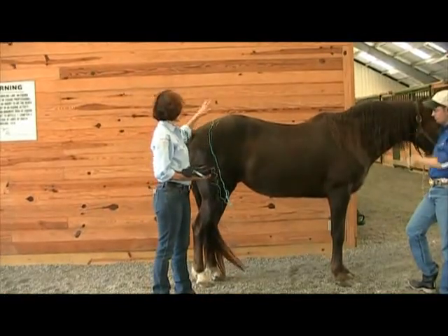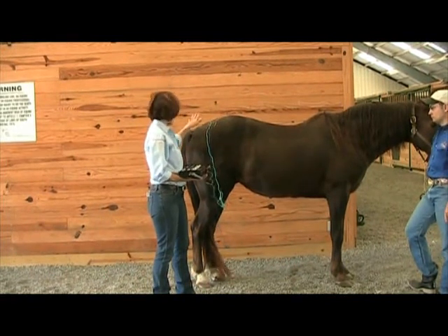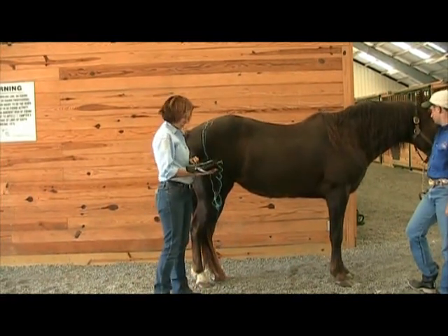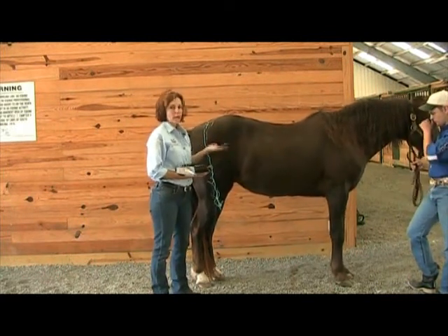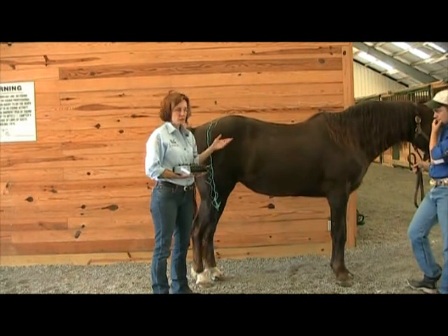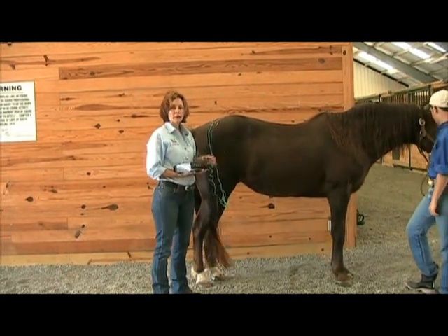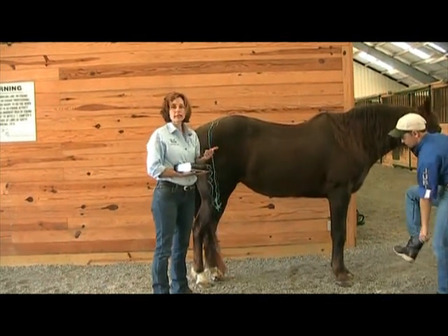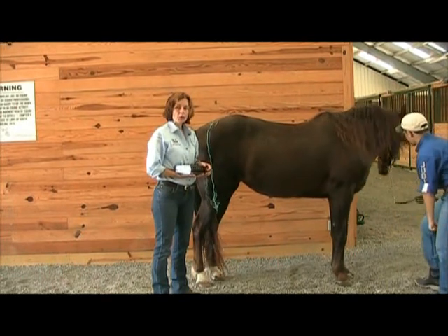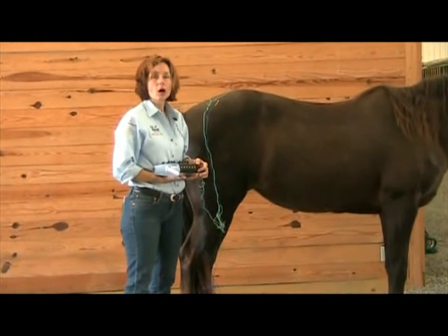And what is going to happen is she's going to get a small electrical impulse to these acupuncture needles to stimulate those points to help relax and relieve those symptoms. We'll leave it on for about 15 to 30 minutes, depending on the problem. And we may repeat it daily, weekly, or monthly, depending on the problem. Otherwise, this will help with harmonizing her normal health.